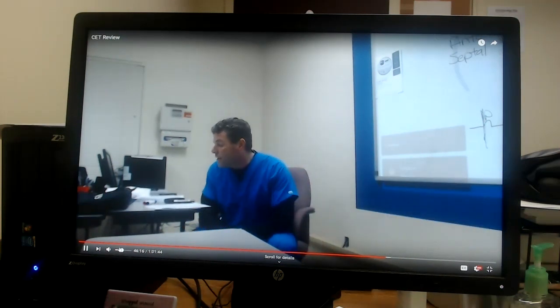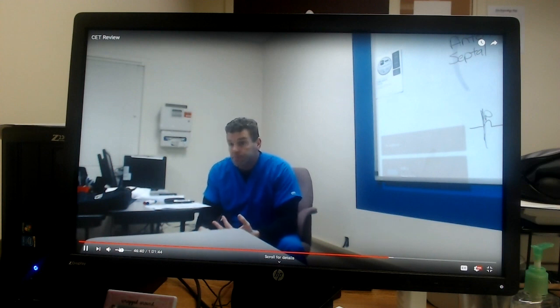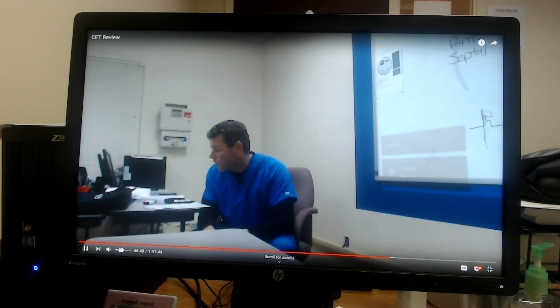An EKG technician is preparing to perform telemetry monitoring on a patient. Which of the following locations should the technician attach the electrodes? Okay. Yeah, we're not going to put them on the head, obviously. It's not an EEG, it's not an electroencephalogram. We're not going to put them on the legs, okay? These people are ambulatory. We're not going to put them on the arms. They may have IVs or whatever the case may be. Telemetry patients are basically going to be your cardiac floor patient, so we're going to have them all on the chest.